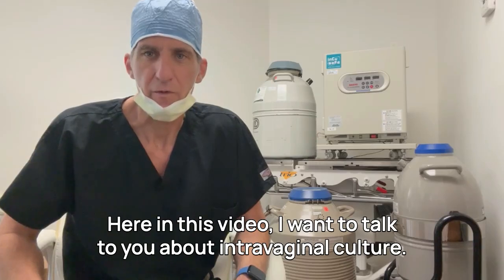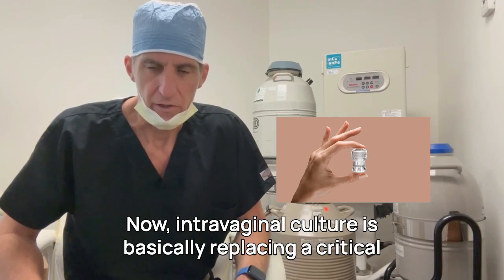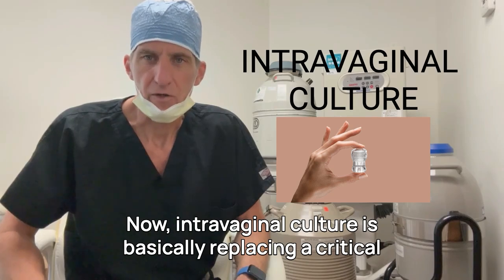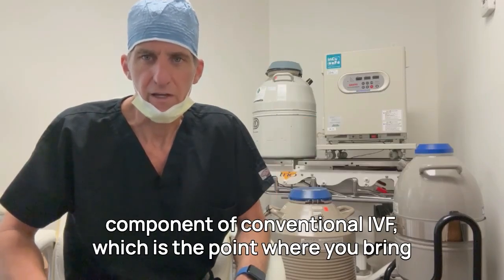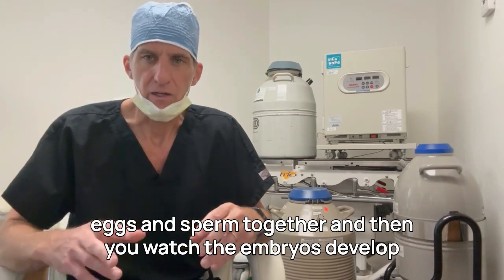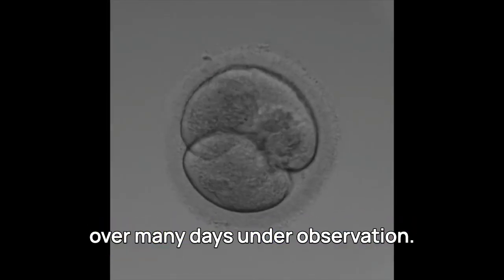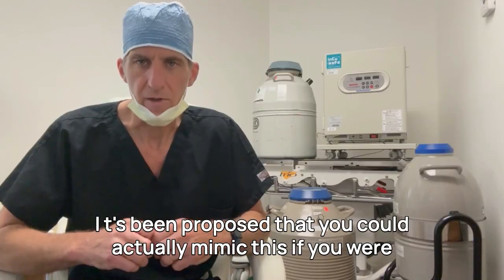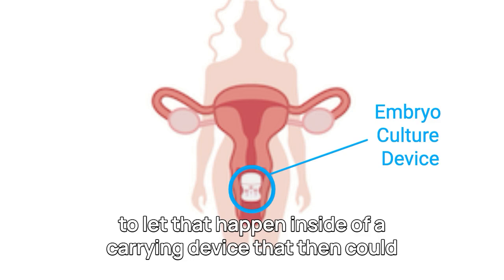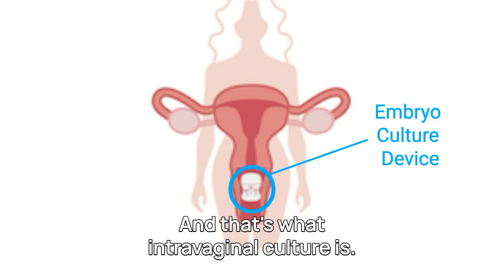Here in this video, I want to talk to you about intravaginal culture. Now, intravaginal culture is basically replacing a critical component of conventional IVF, which is the point where you bring eggs and sperm together, and then you watch the embryos develop over many days under observation. It's been proposed that you could actually mimic this if you were to let that happen inside of a carrying device that then could be carried inside the vagina. And that's what intravaginal culture is.